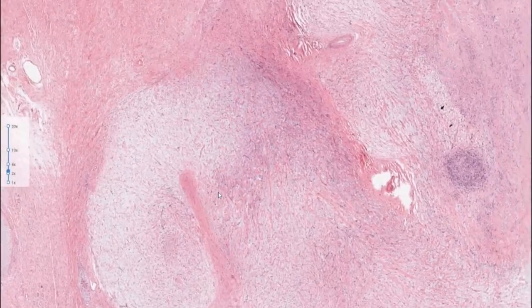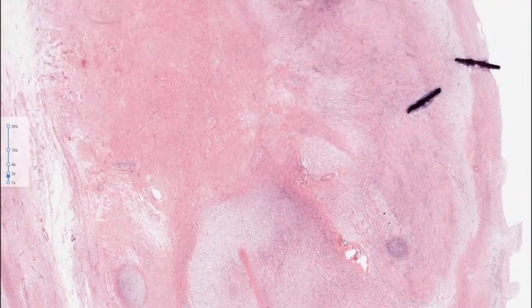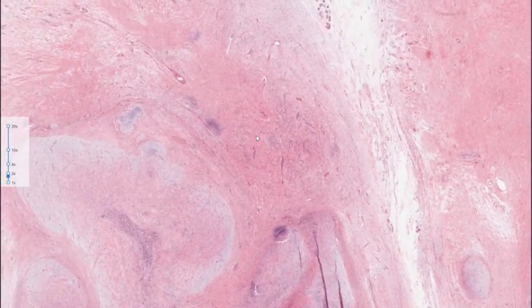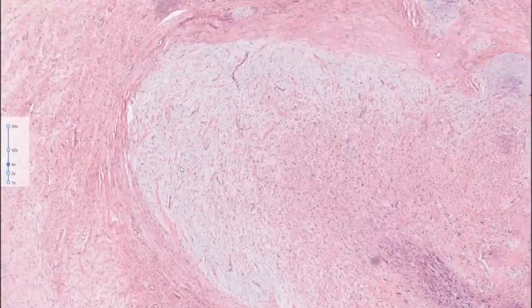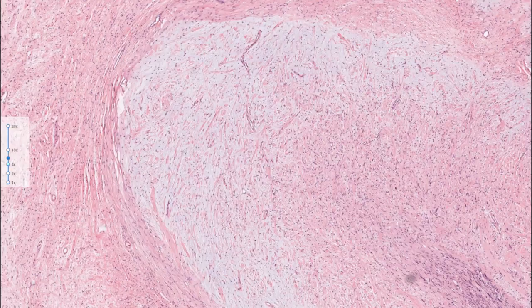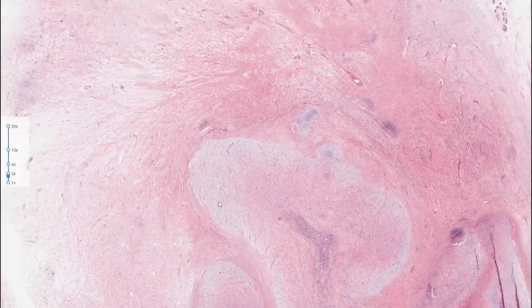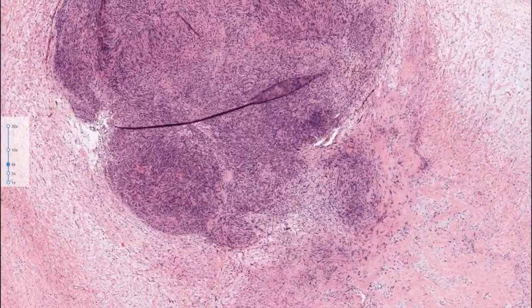It's almost pathognomonic of the disorder, with the exception that there are a few that can be superficial or small and may not be associated with the disorder. It can probably be thought to be related to a more localized clonal expansion of cells that have lost NF1. But if you go high power, again, the histology is very similar to neurofibromas of different types. Now, something that was interesting, and hopefully you caught it, was this here. You have this nodule here.